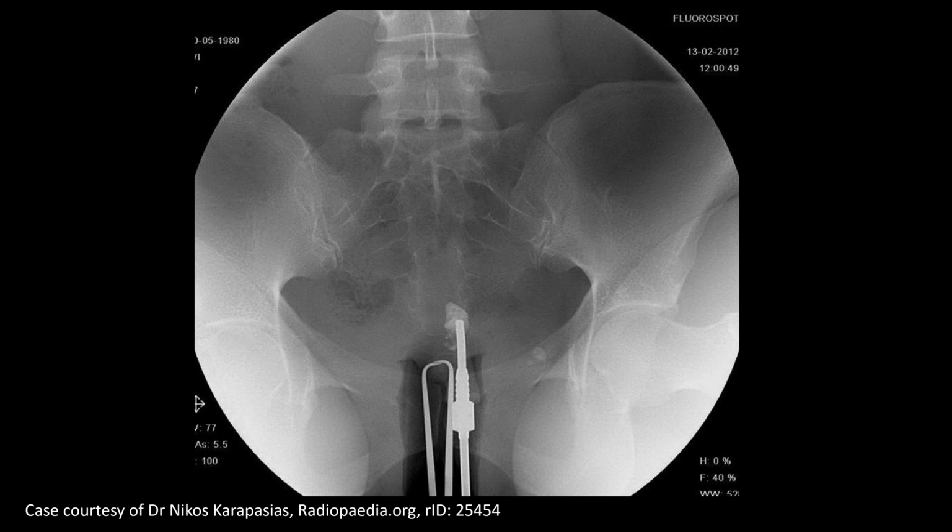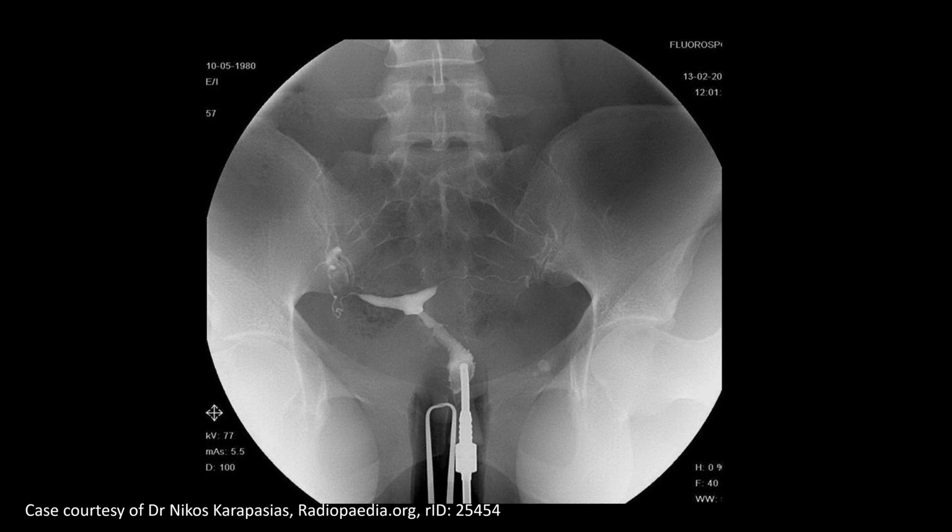Now this is the image where you can identify the cannula as we saw in the previous video. This is the vaginal speculum. We will inject dye here. This is the ala of the sacrum and this is the iliac crest. So this is the pelvic cavity. Okay, here we will inject the dye. Let's see what happens. So we have injected the dye.